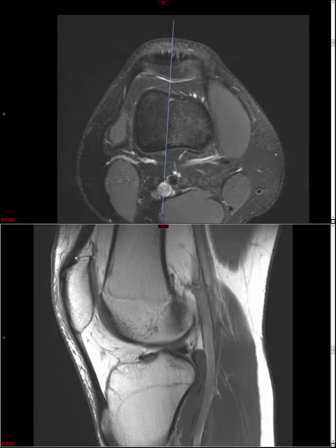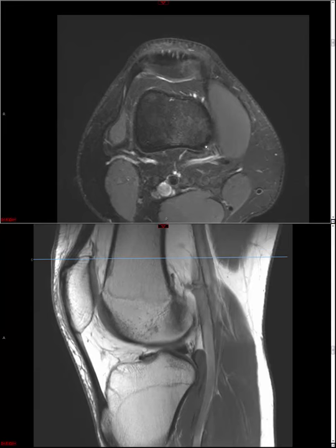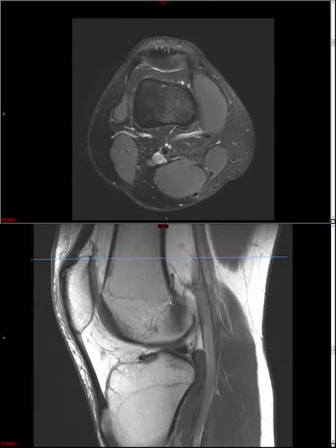If it looks heterogeneous and thickened, we might query some tendinosis, and if we see actual disruptions or fluid signal defects within the tendon, then we're going to start talking about partial thickness tears. If there's complete discontinuity, then we're dealing with a full thickness tear, and in a quadriceps tendon rupture we may actually see a patella baja, so the patella kind of sinking down inferiorly. If there's a partial tear, sometimes it's helpful to give an approximate cross-sectional area percentage of involvement. That seems to be a very intuitive figure that the reader can really hang their hat on.